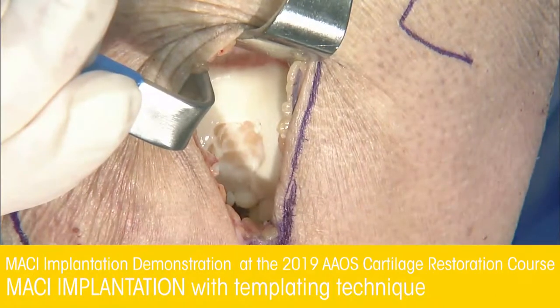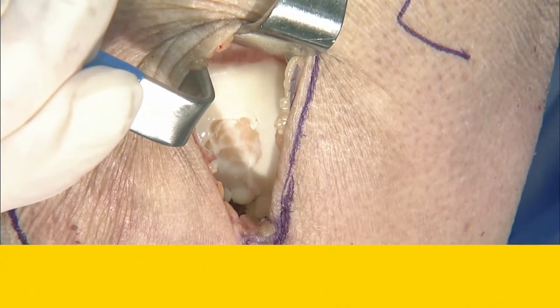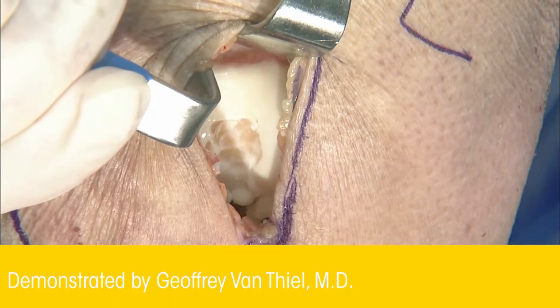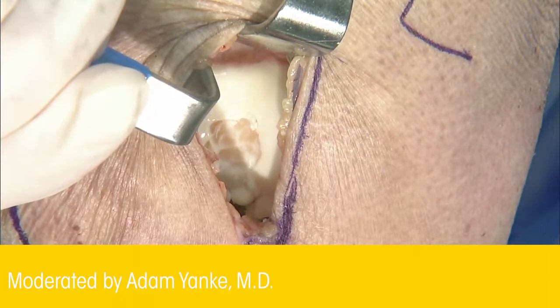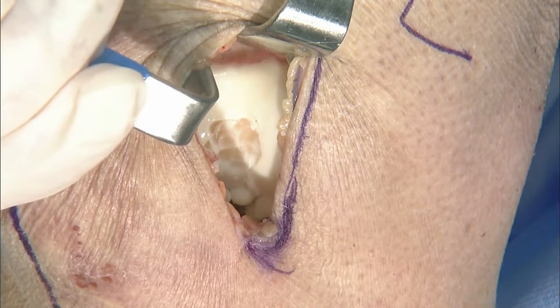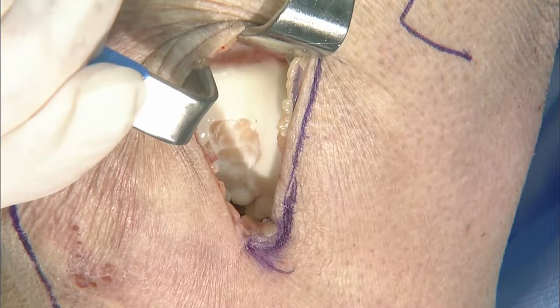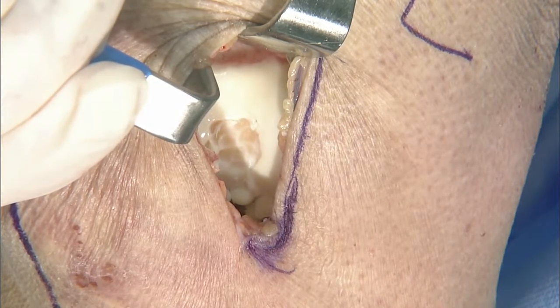So I've created what we'll say is a defect, meaning we're just getting into the knee and we look at it here. And I think especially as you get in the patellofemoral joint, like the trochlea and the patella especially, like Adam said, it's really, really difficult to figure out what's enough. Because especially in the patella, that delamination can keep going and going and going. And there's oftentimes not a right answer in terms of how much or how little. And you can get into taking quite a bit sometimes. But then also you want to make sure that you're taking enough.